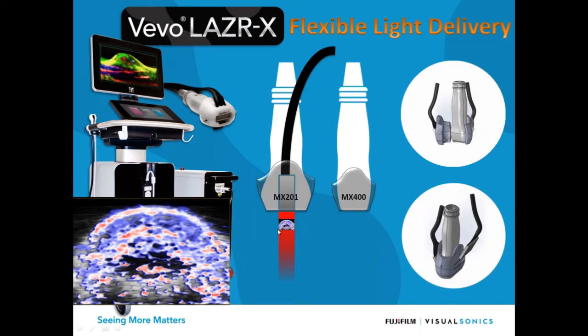I'm really excited about some of the possibilities for this because now the light delivery can be paired with the application instead of being stuck with using one particular transducer with one particular way of delivering the light.